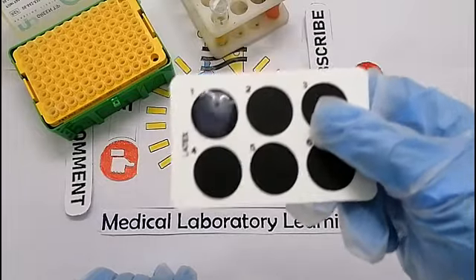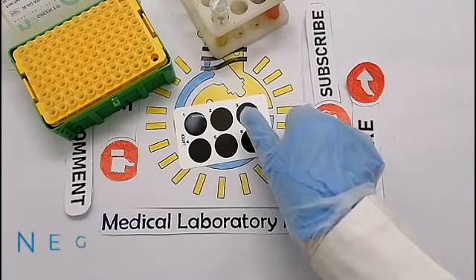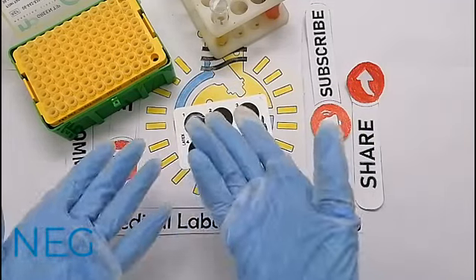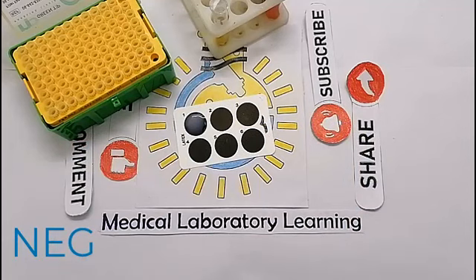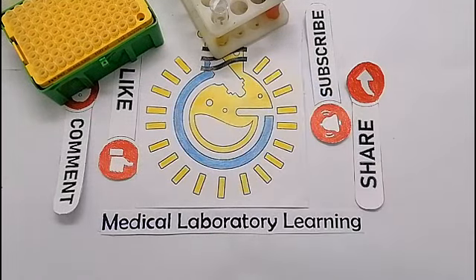After 1 minute, we read the result, and here you can see that no agglutination is observed, indicating that the patient has normal CRP levels and the test result is negative.